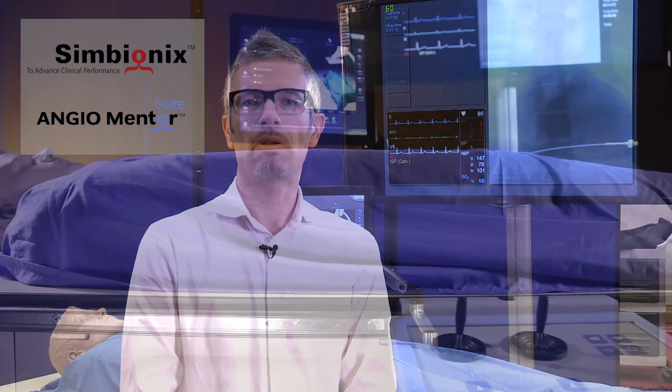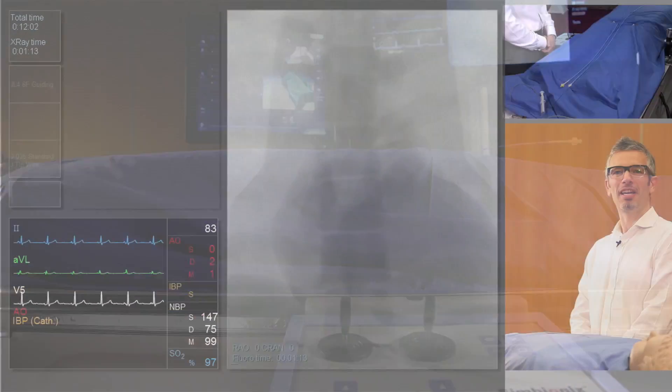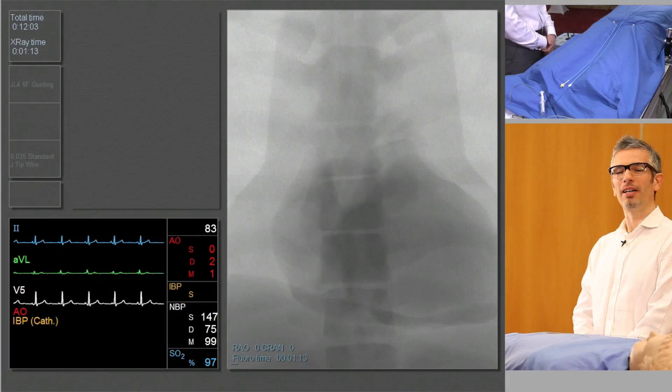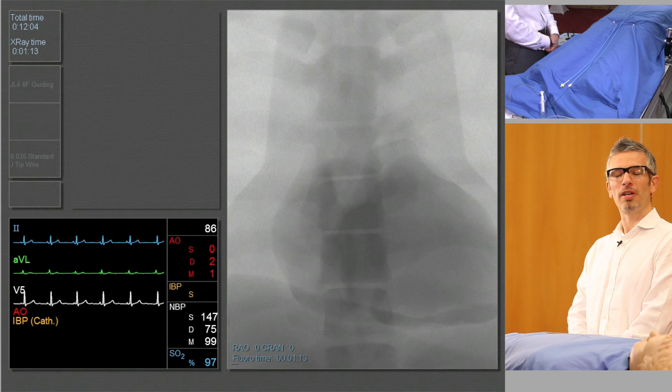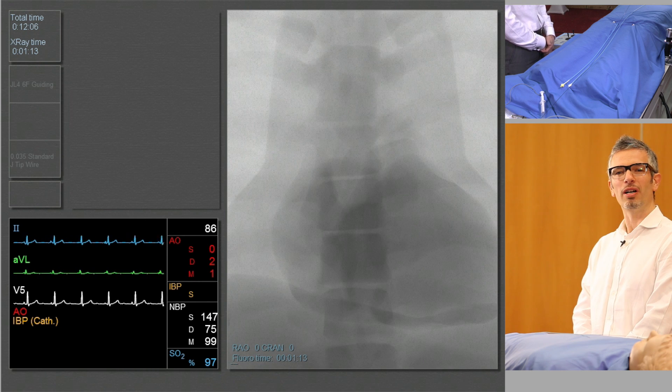Hi, I'm Alan Bagnall. I'm an interventional cardiologist. Today we're going to be using the Symbionics Angiomenter to perform a catheterization of the right coronary artery and of the left coronary artery. We're going to start today by showing you a demonstration of catheterization of the left coronary artery.